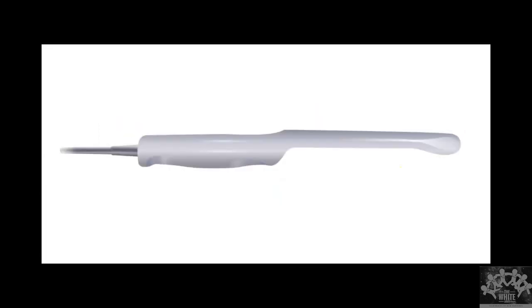Now, this is a transvaginal or transrectal probe, which is very thin so that it can be easily passed. On the tip of it, there is a curvilinear probe. It is very small, unlike our linear probe. The linear probe was slightly bigger, so it was covering more area. This is made very small so that it can be passed through orifices. But its tip is made curvilinear so that it gets a wide sector of area to cover, so that a large area can be covered.